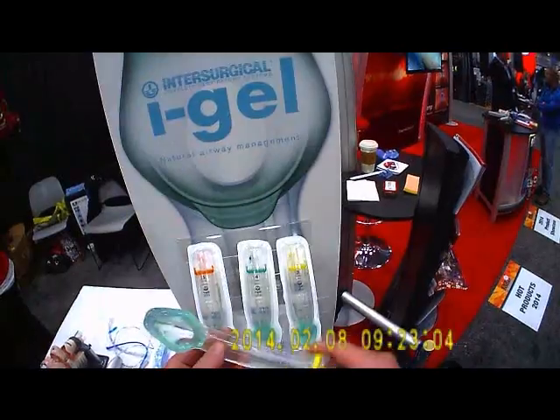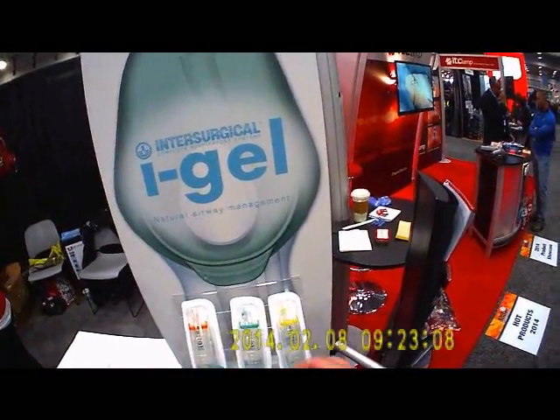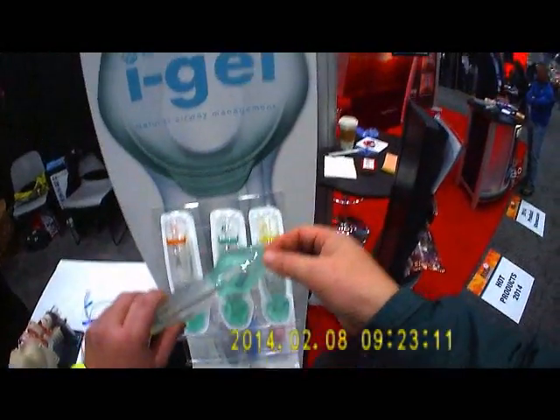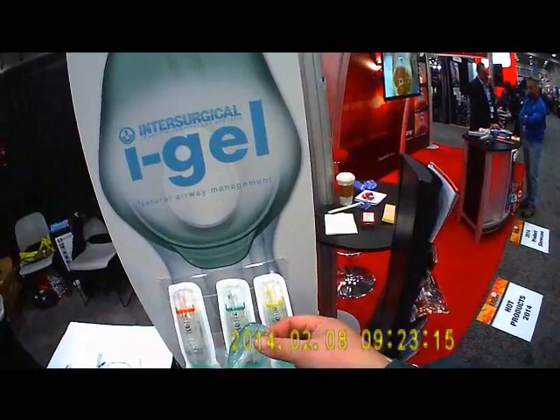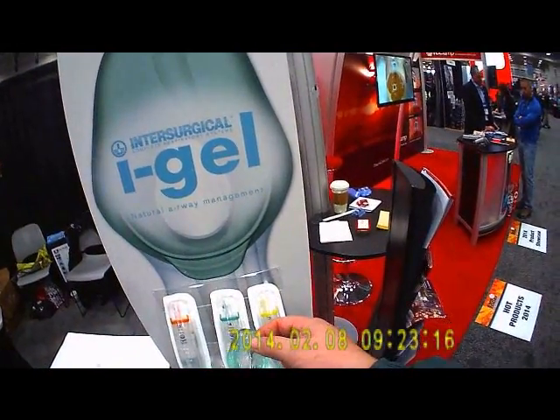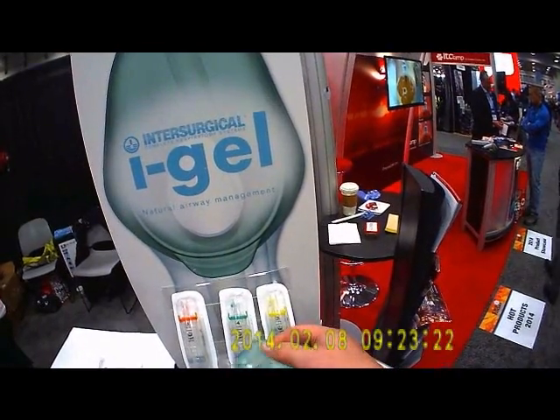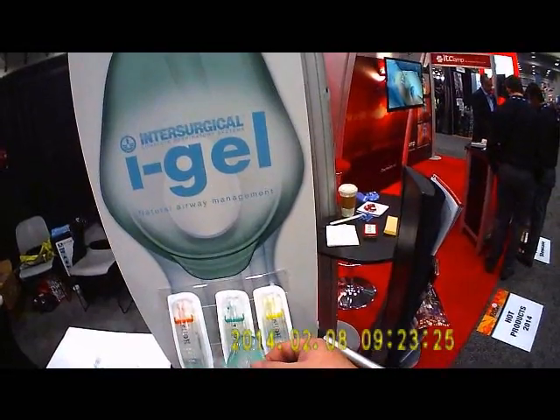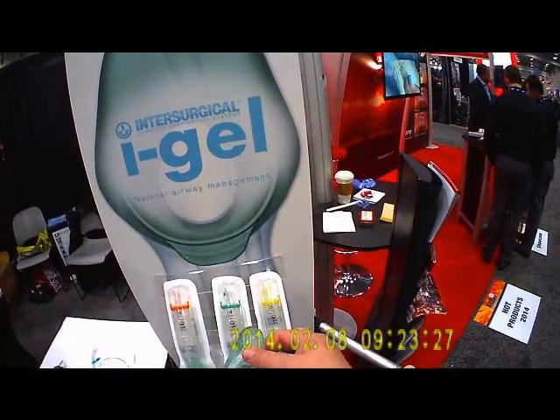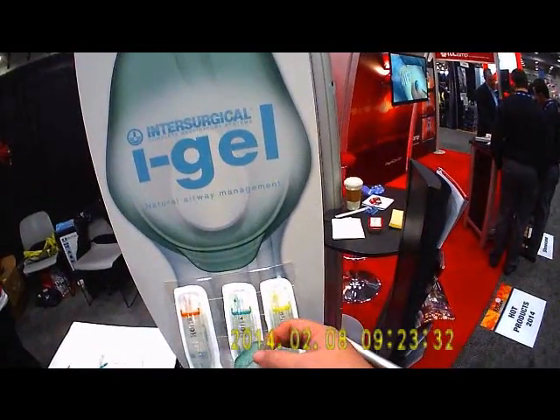The iGel, if you've never seen this thing, is basically just a laryngeal mask airway, but rather than an inflatable cuff, the cuff on the iGel is gel-filled. This hopefully takes away the concern published in some recent studies about the large pharyngeal balloon on some supraglottic airways impeding carotid artery blood flow during resuscitation and lowering the chance of a good neurological recovery.